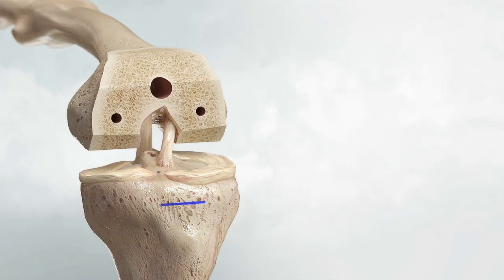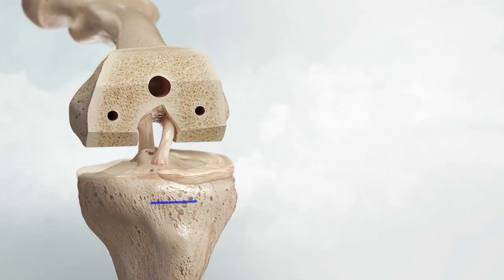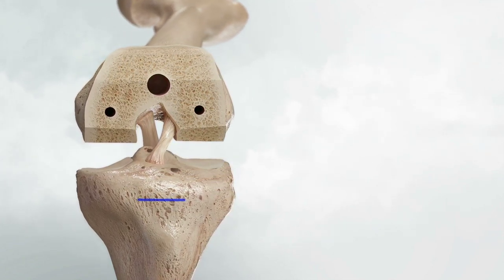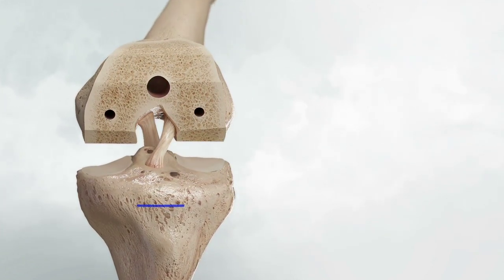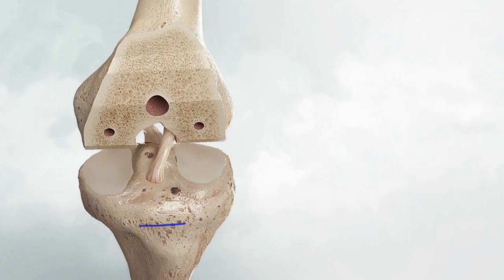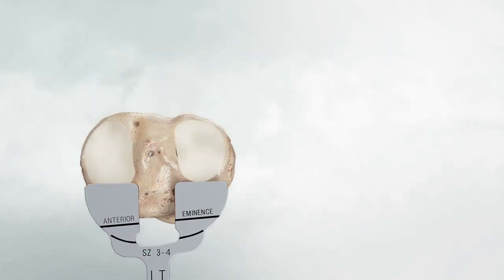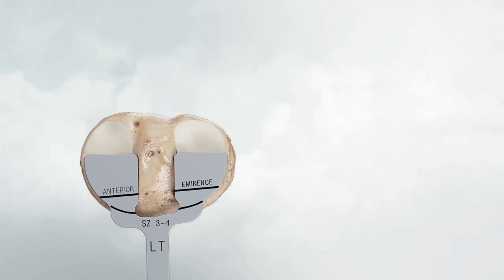Before beginning any tibia preparation, ensure that as much of the medial and lateral meniscus is removed as possible, which will help with exposure and bone removal. With the knee in flexion, use the tibial sizing template to visualize baseplate rotation and medial-lateral placement according to the following steps.